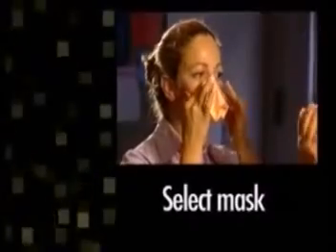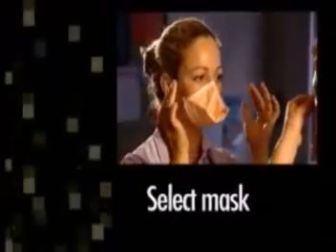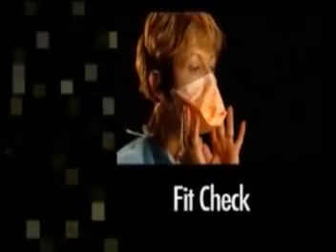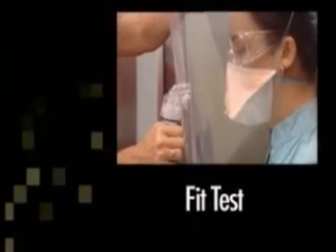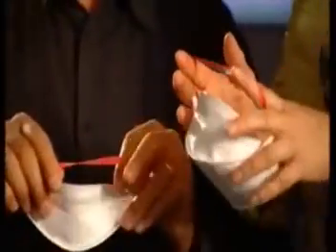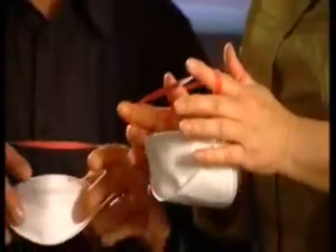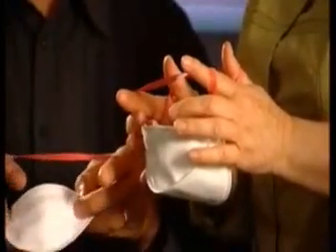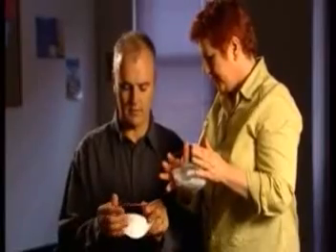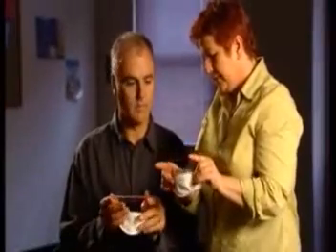These masks must be put on correctly, successfully fit-checked, and fit-tested for the individual. A respirator mask may compromise a person's health if they have a history of respiratory illness. In this situation, they should be medically assessed to ensure they are physically fit to wear this type of protective device.